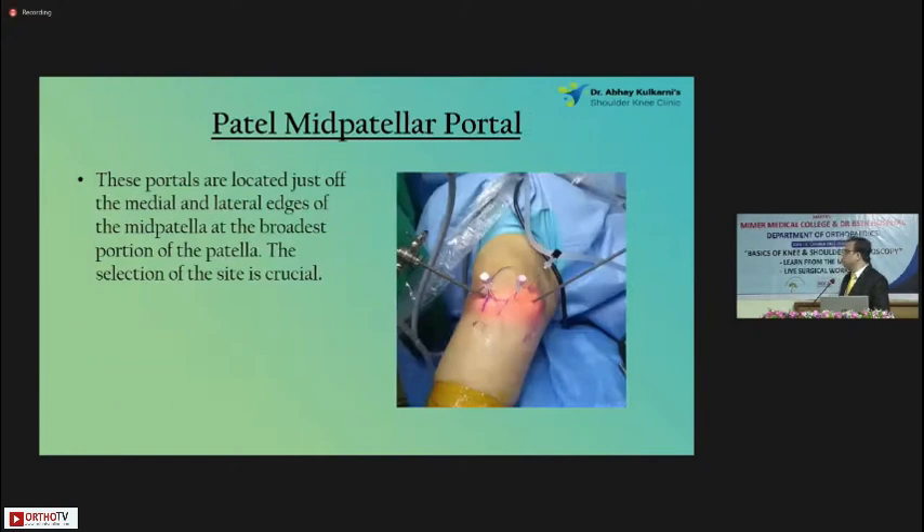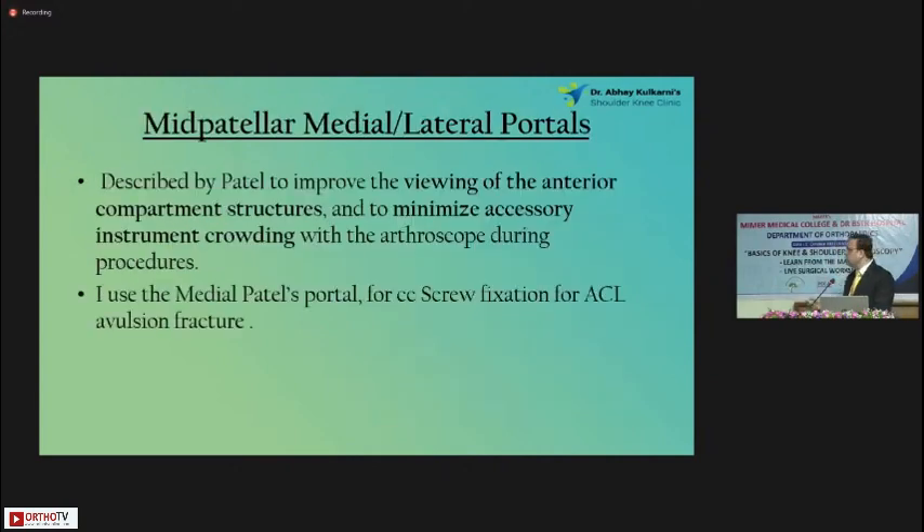The mid-patella portal is a very good portal. The portal is located just off the medial and lateral edge of the patella — that black needle you see, that's the patella portal. Its main use is for viewing anterior compartment structures. Most importantly, it helps avoid crowding of your instruments, because with the anterolateral portal the anterior aspects of the menisci may not be very clearly seen. A patella portal is always handy — you should know how to make it. I use it whenever I'm fixing an ACL avulsion with a screw, using the patella portal to pass the wire and the screw.